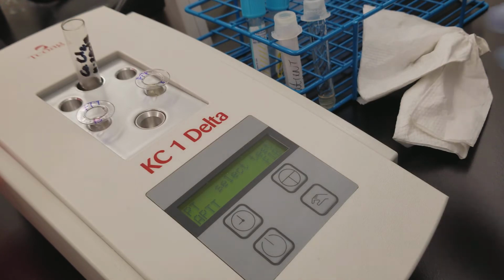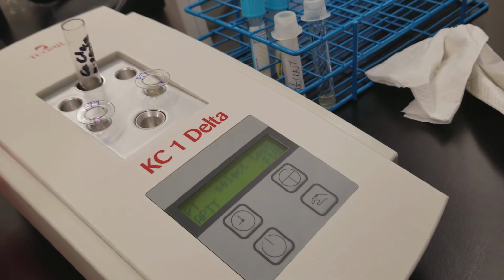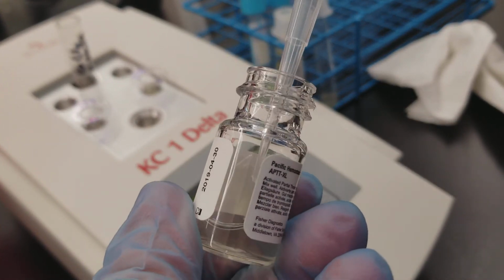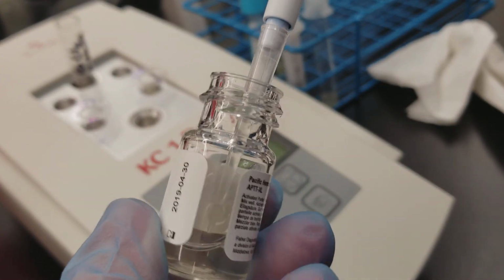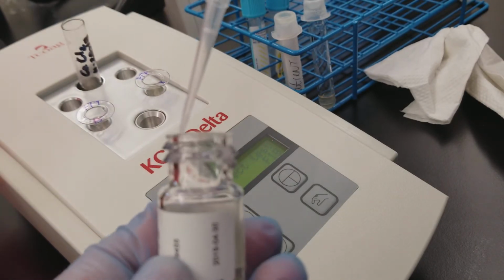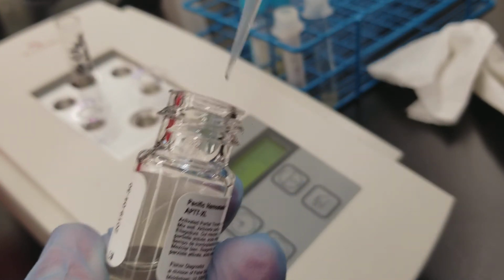Put a new tip on there. And since I'm doing reagent in both of them, I can use the same tip as long as I don't put the tip in the cuvette itself. Okay, so I don't need to replace my tip here because I didn't touch any of the patient specimen that's in there.